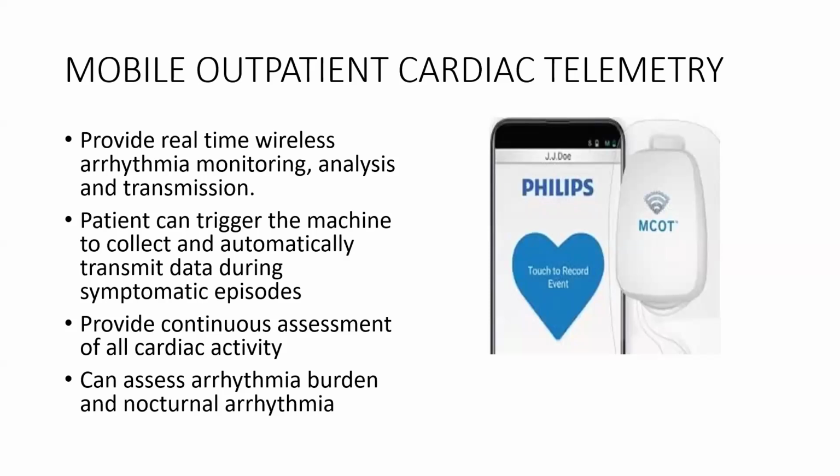So it gives real-time information. You can also assess arrhythmia burden and, most importantly, nocturnal arrhythmia. Those are examples of the devices we've talked about and their key features.